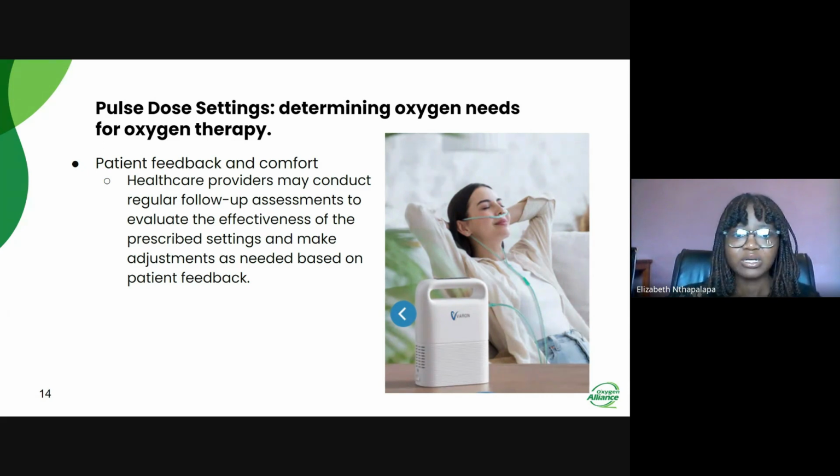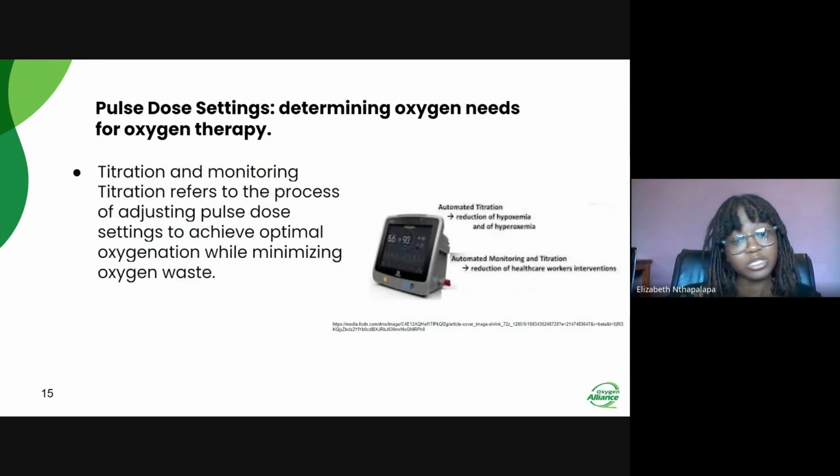And lastly, we are going to look at titration and monitoring. So we may want to understand what titration is. I've put a simple meaning here: titration and monitoring refers to the process of adjusting pulse dose settings to achieve the optimal oxygenation while minimizing oxygen wastage.